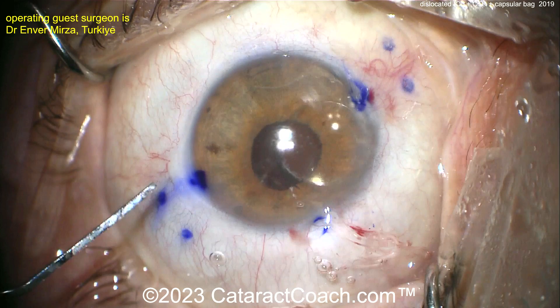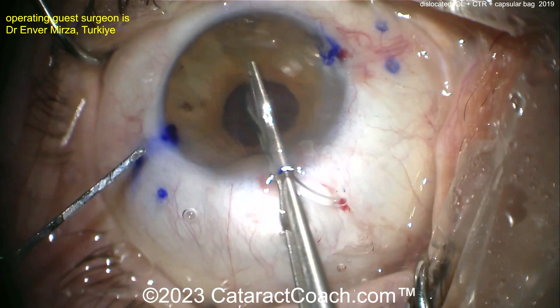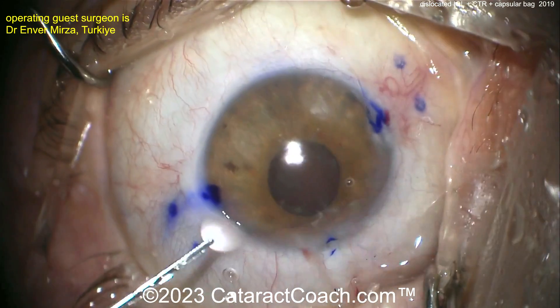Going underneath it with probably more viscoelastic. It looks like a twist-and-out technique — that's our favorite way of doing it. Grabbing the IOL optic edge and then twist, twist, twist, twist, and pull it right out.